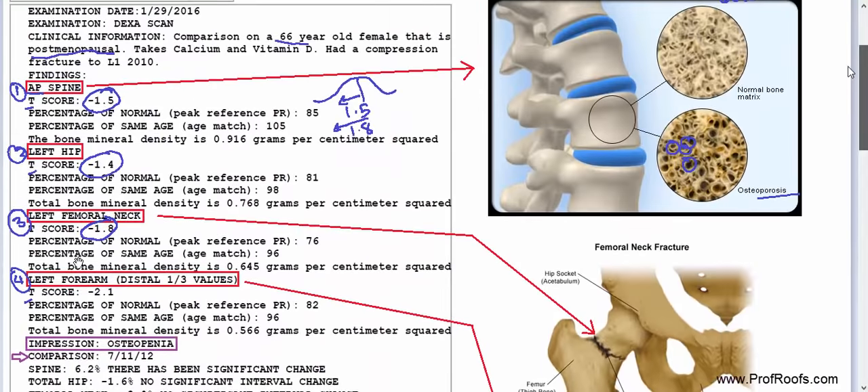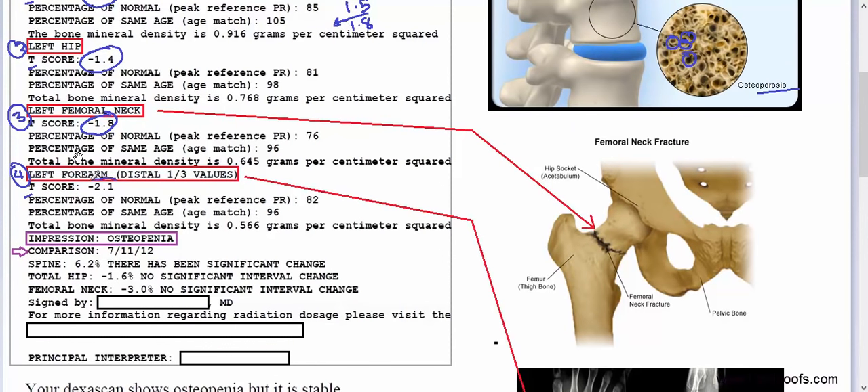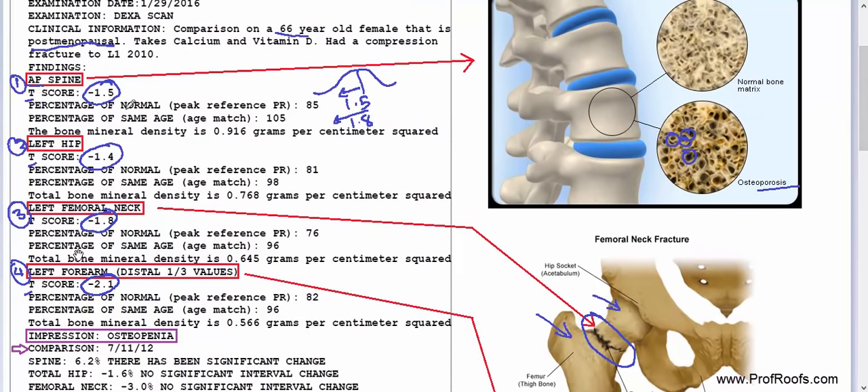Looking at the forearm, one research article noted the forearm has one of the lowest scores in about 40% of subjects tested, so it's used as an indicator of bone mineral density as well. And just to point out the neck of the femur — that's where you get a lot of hip fractures because it's a weak area between the head of the femur and the greater trochanter.